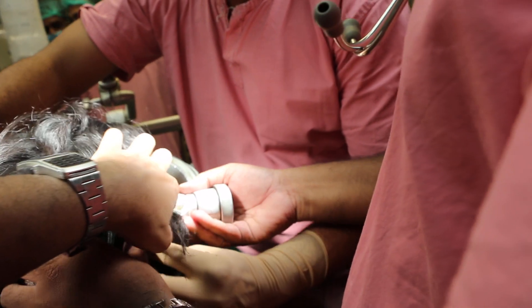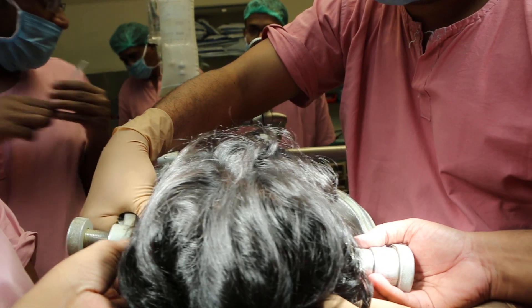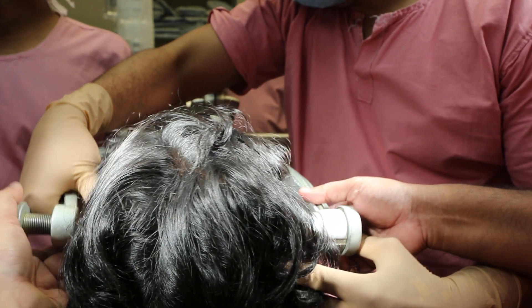Because the head is not shaved, you have to be careful. Make it horizontal, make it horizontal. Yeah, make it horizontal — bring this side up, right side up. Okay.